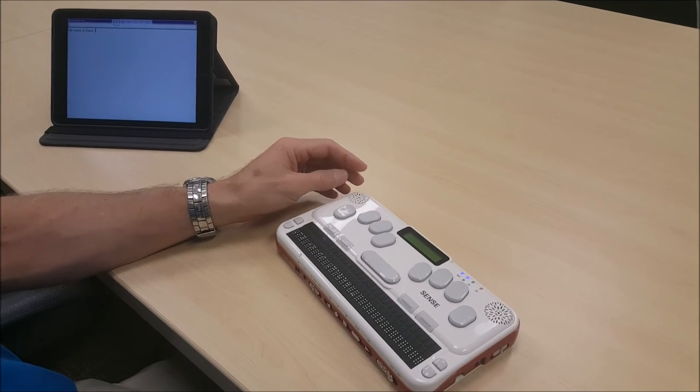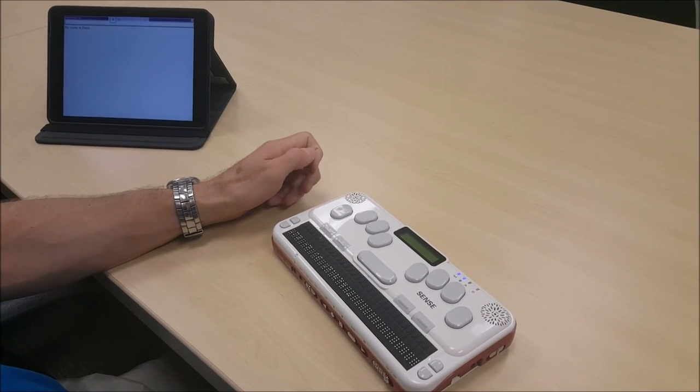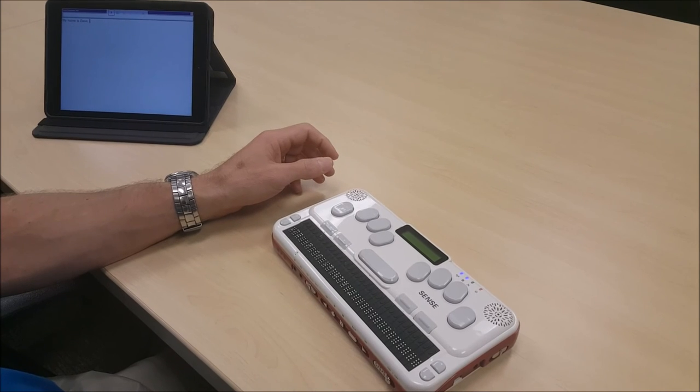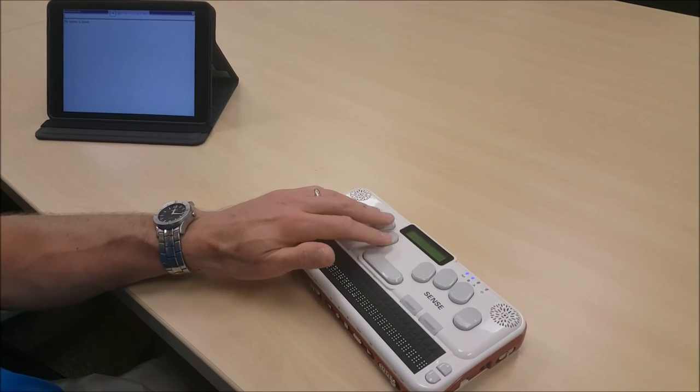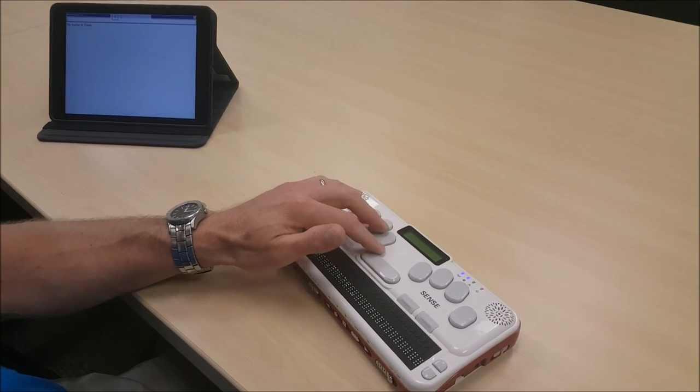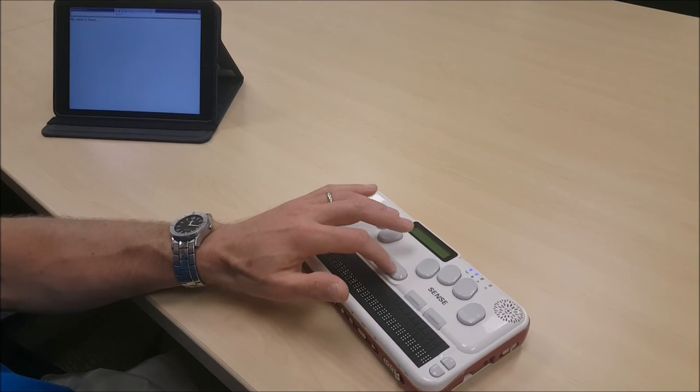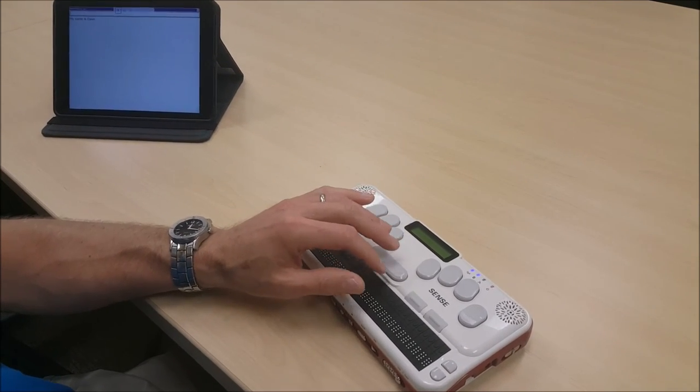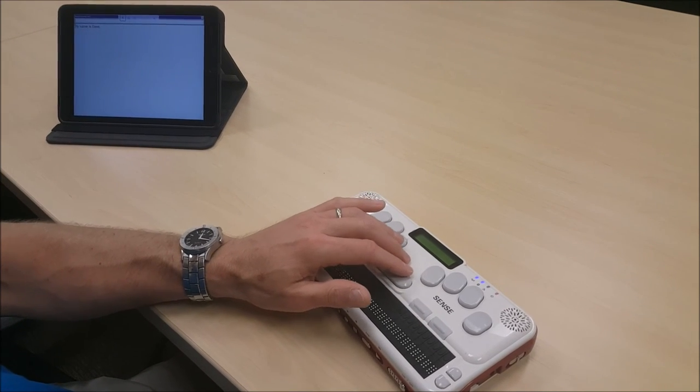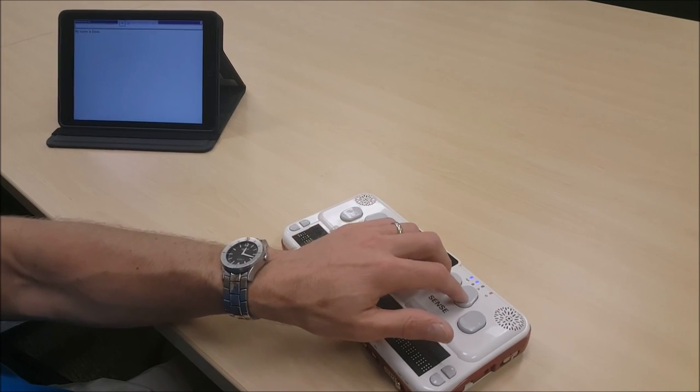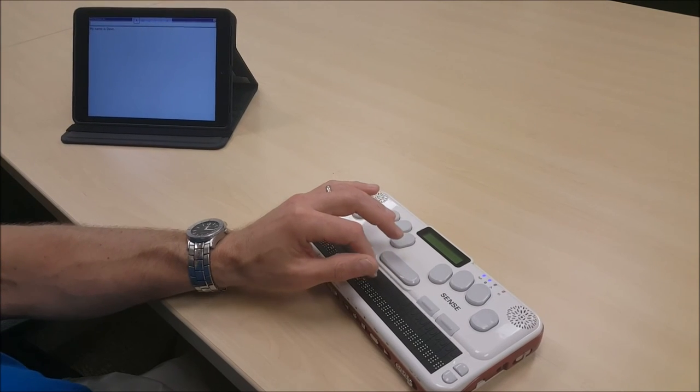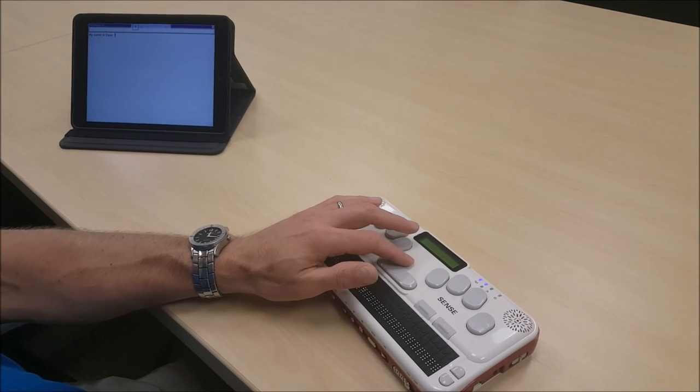I can use typical navigation commands for moving around my document. For example, if I want to go to the top of the document, which is dots 1, 2, 3 in the space bar, I can press space, dots 1, 2, and 3 in the space bar. Top of document. To go to the end of the document, I would press space, dots 4, 5, 6, and space.